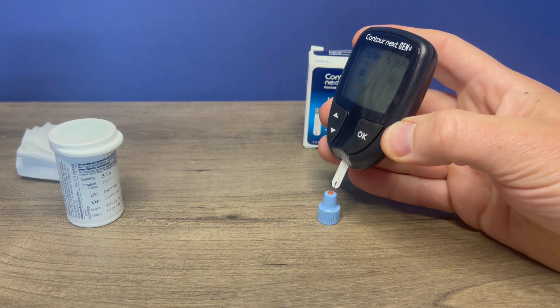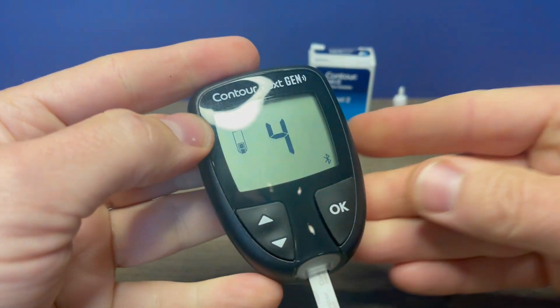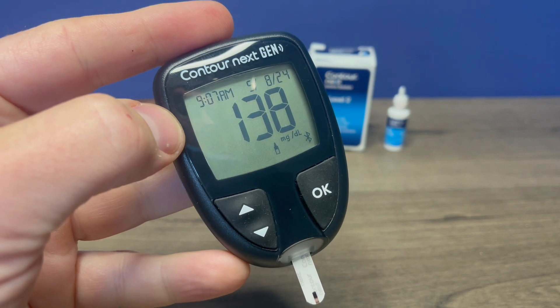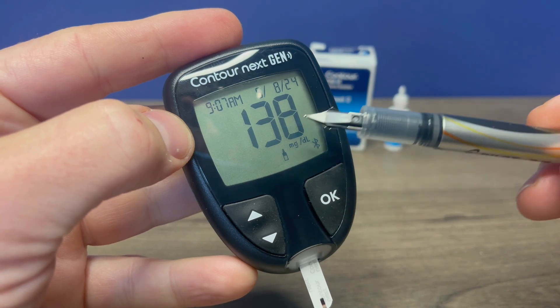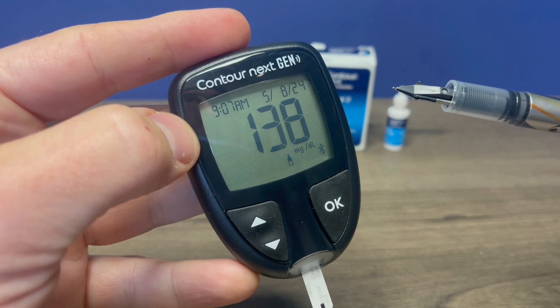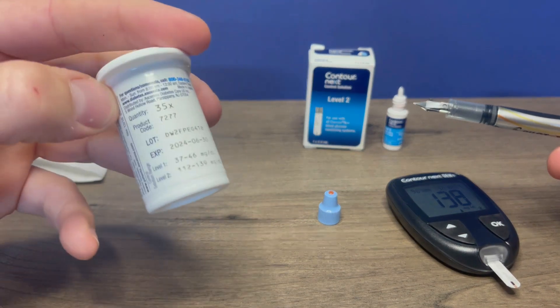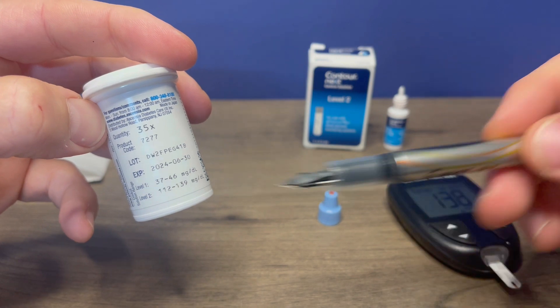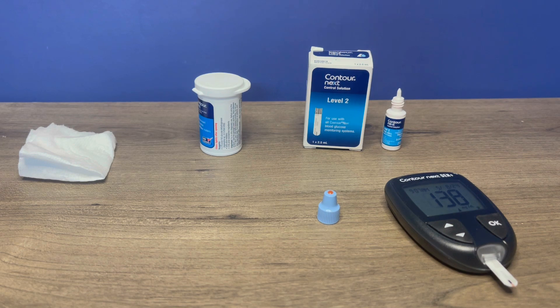Then you touch it just like you're testing your blood sugar. If we notice, it does have the little control solution icon on the display, so it's letting us know this is a control solution test. This has nothing to do with your blood sugar, simply the control solution. The result is 138. This is level two, so we go to the bottle and look at level two — it should be between 112 and 139. 138 is within that range, which means your test strips are testing within range.